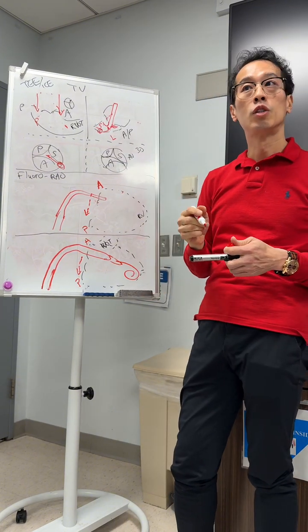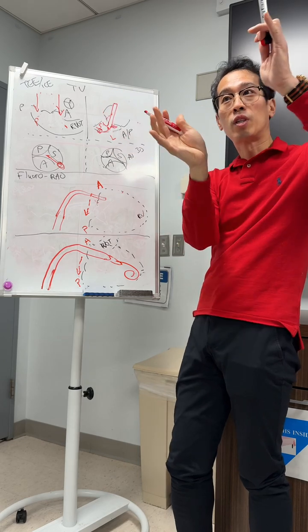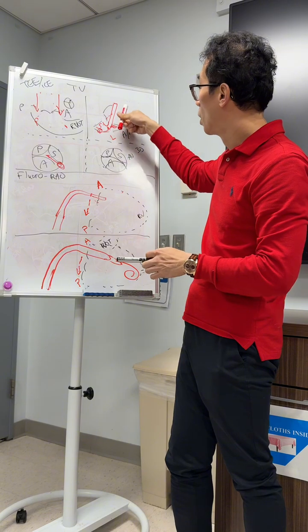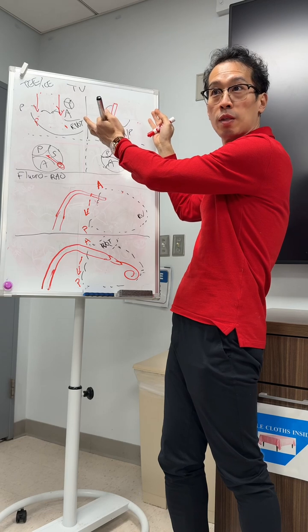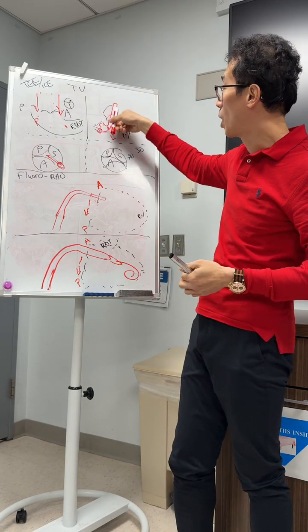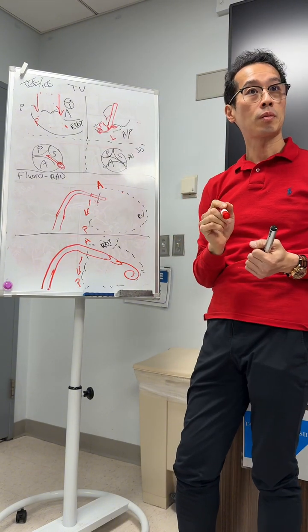Agree? So you need to do a flip. But the problem is that if you do too much of a flip, you can't swing to grab the leaflet. So you need to be able to get enough exposure of the anchors to be able to grab the leaflet. But if you have a septal hugger or lateral dive, you're going to struggle.